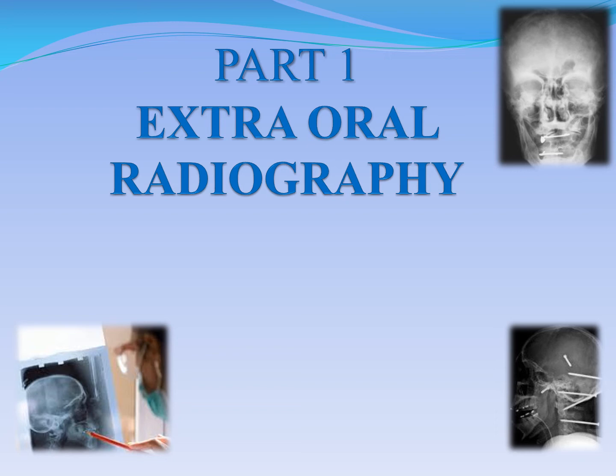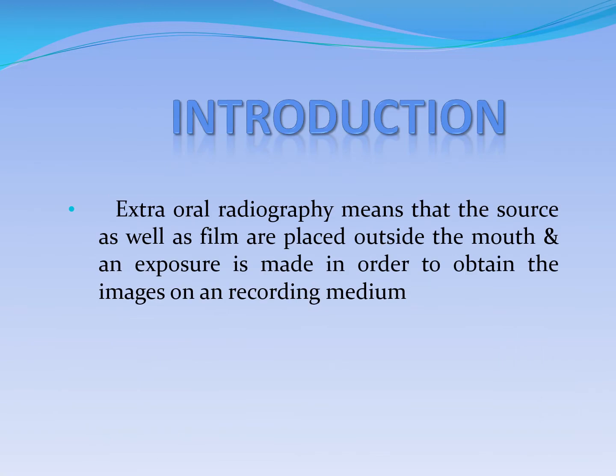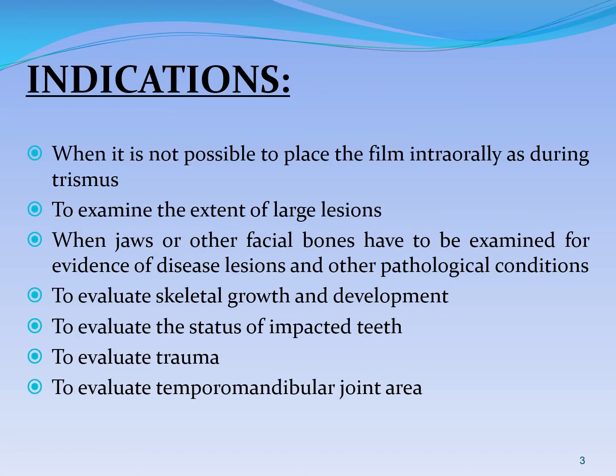Welcome everyone. Today's topic is extraoral radiography, part 1. Extraoral radiography means that the source as well as the film are placed outside the mouth and an exposure is made in order to obtain the images on a recording medium.